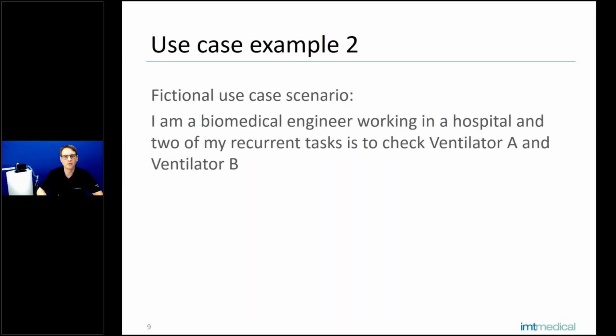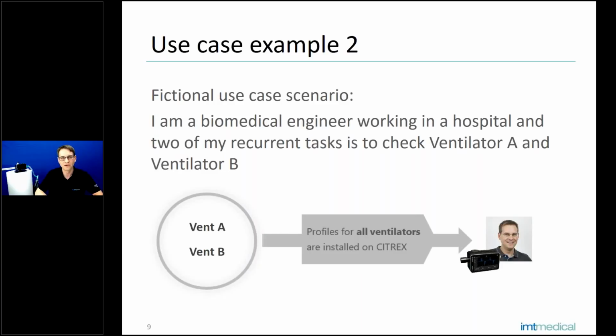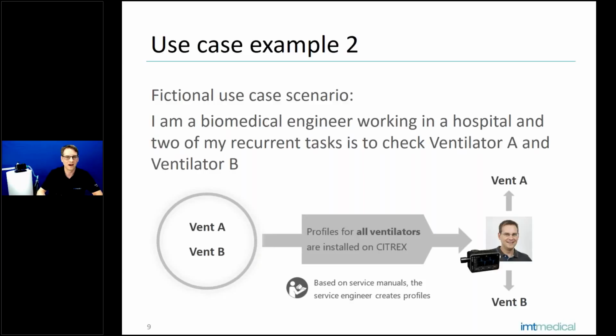Let's assume that I am a biomedical engineer in a hospital and 2 of my recurrent tasks are to test ventilator A and to test ventilator B. So what I'll do is I'll create profiles for this ventilator A and ventilator B on my CITREX based on information which I can find in the service manual, because in the service manual I have all the information about what to test and how to test and which settings I have to use.